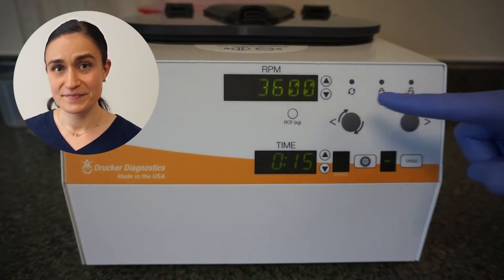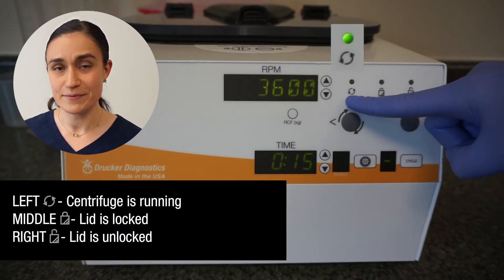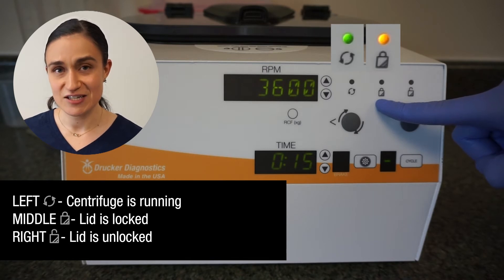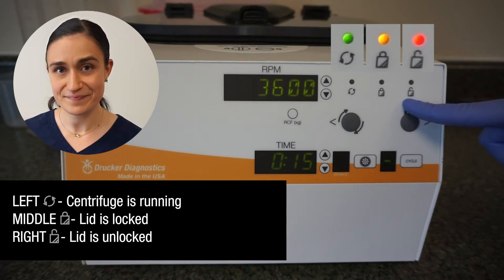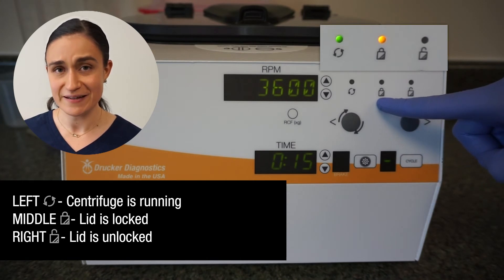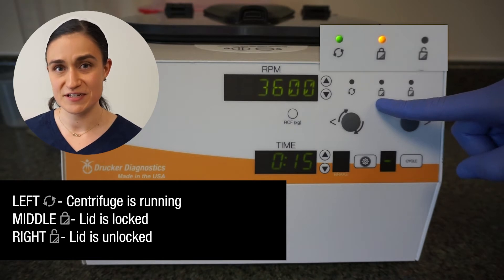To the right of that, we have our indicator lights. The left-hand light lights up when the centrifuge is spinning. The center light lights up whenever the centrifuge lid lock is engaged. And the right-hand side lights up to indicate that the lid latch is unlocked. The two lights on the left and middle are commonly illuminated at the same time, because the lid lock will automatically engage whenever the centrifuge rotor is spinning.